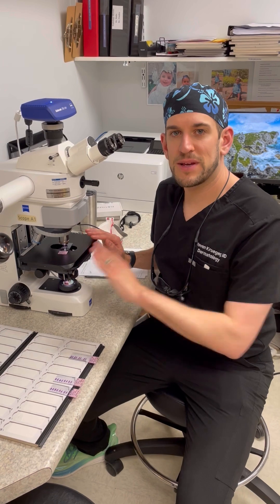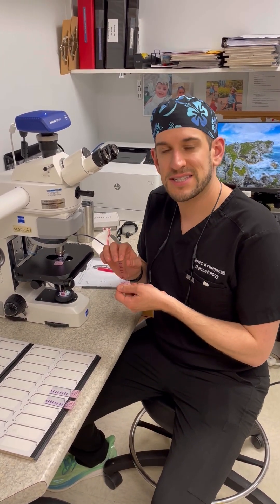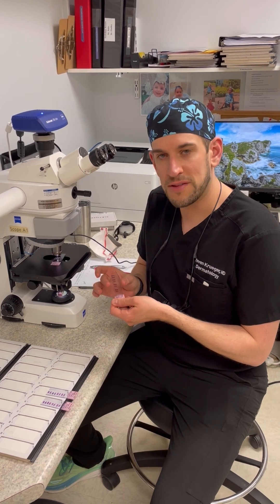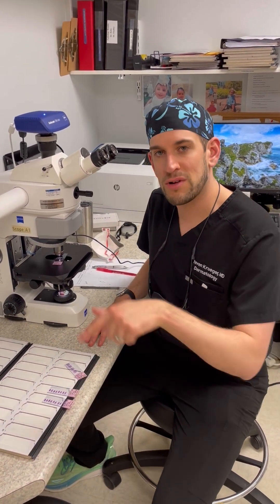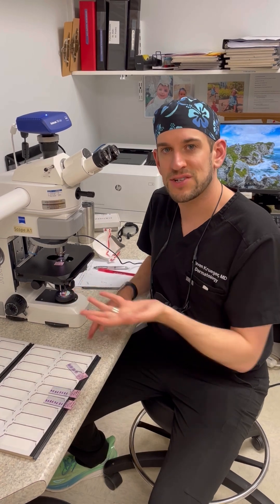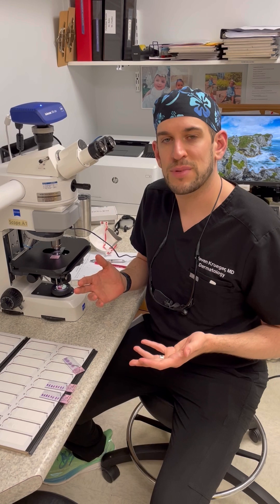The last piece of the puzzle here in the lab is that Amanda has made these glass slides with the tissue on them for me to look at under the microscope, to read all around the outside and deep edges of the tissue we took — to be able to see if there's any skin cancer left behind.